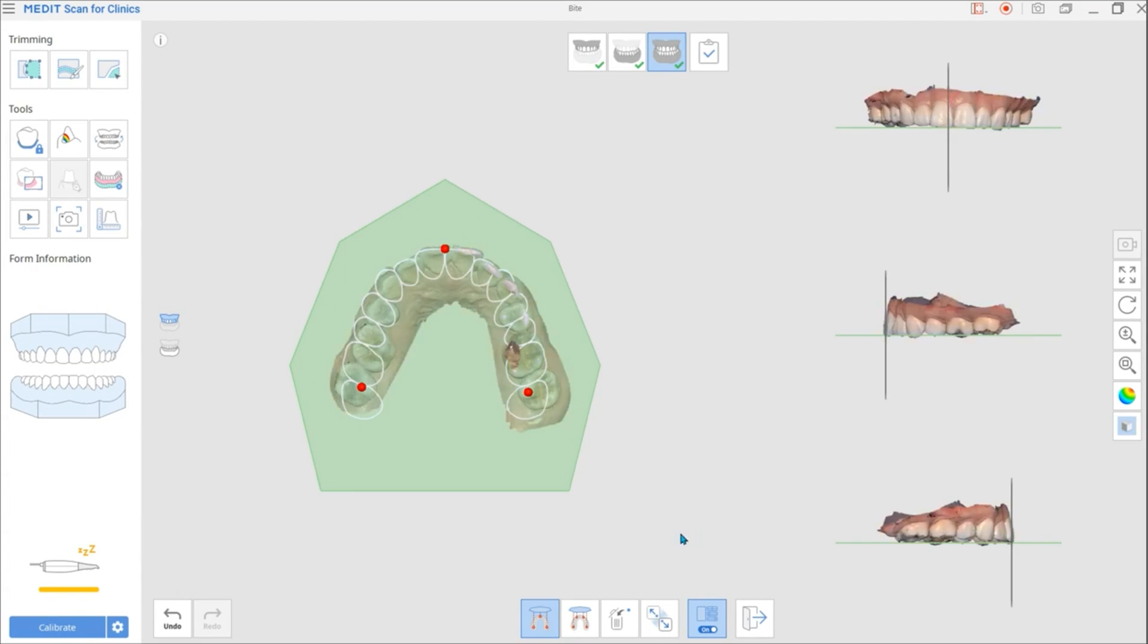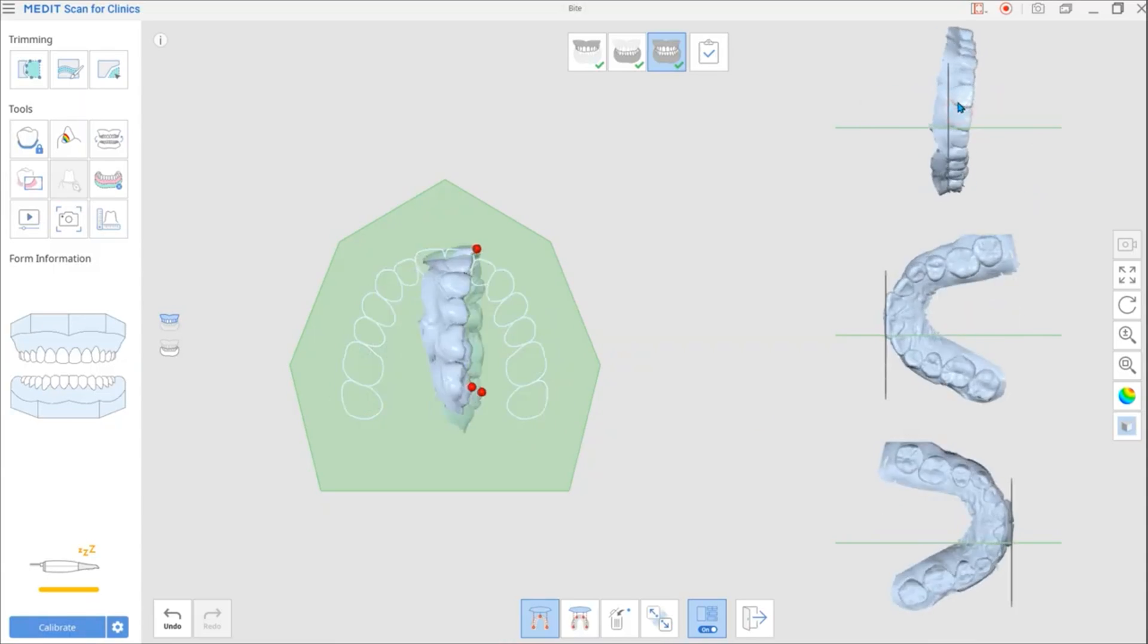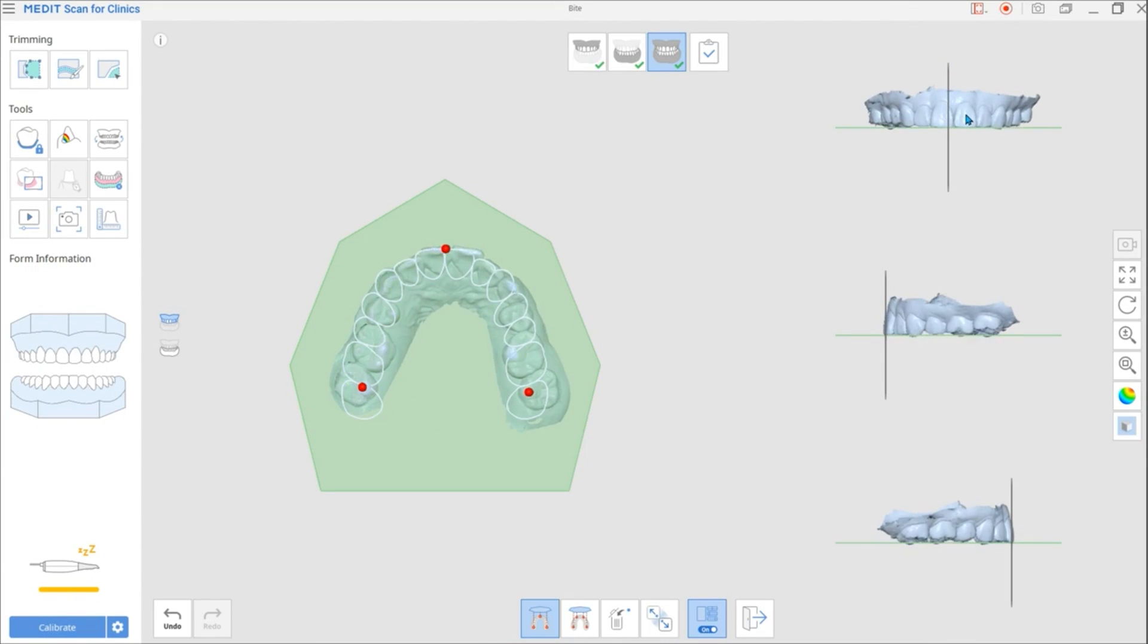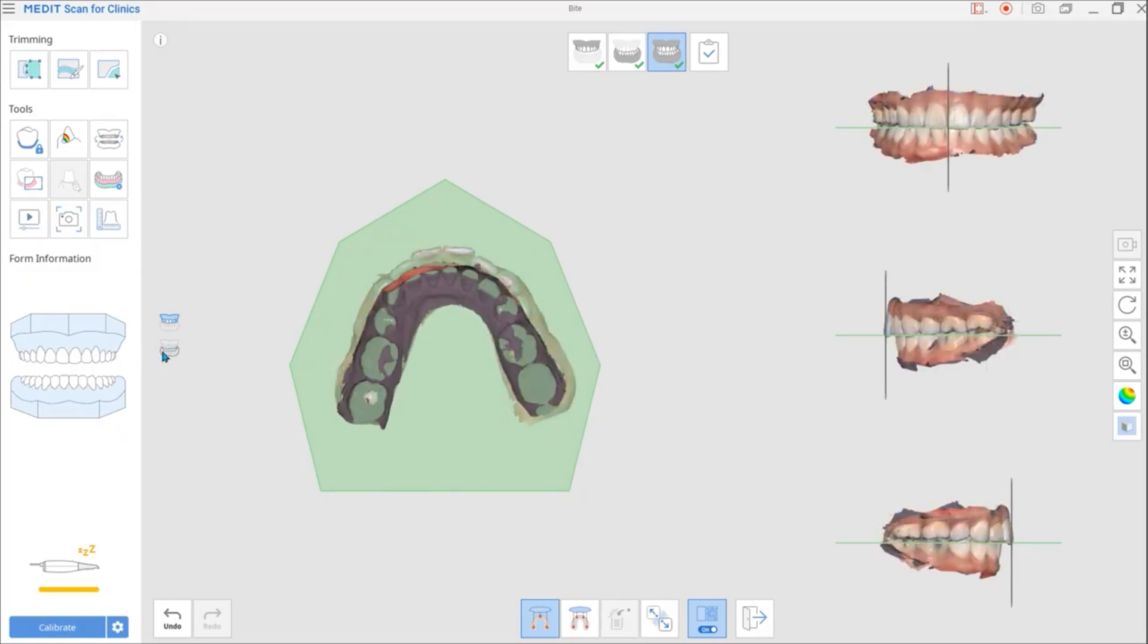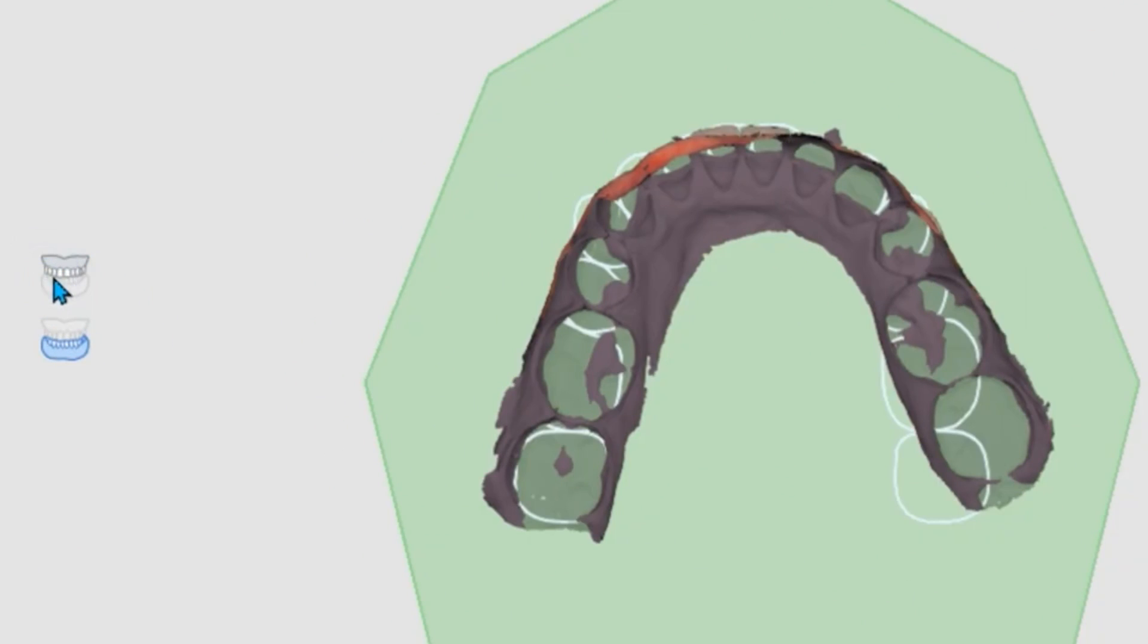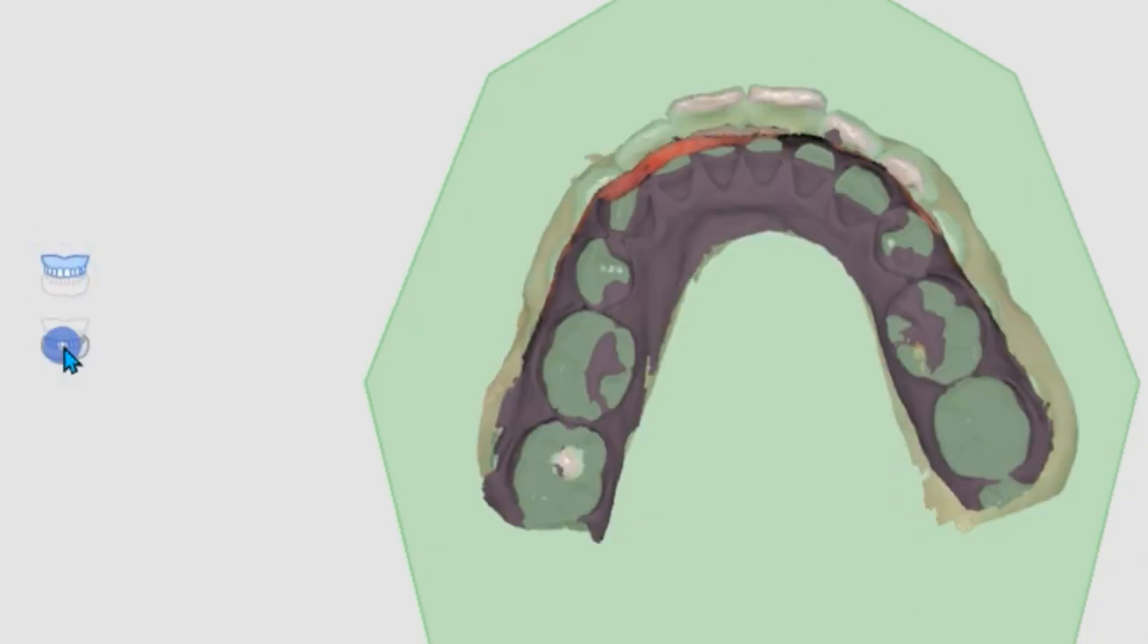According to the position of the points, it'll be aligned with the plane. On the right side, you see a split view of the plane and can adjust it from different angles. On the left side, you can select the maxilla and mandible icon to view the surface of the occlusal plane separately.